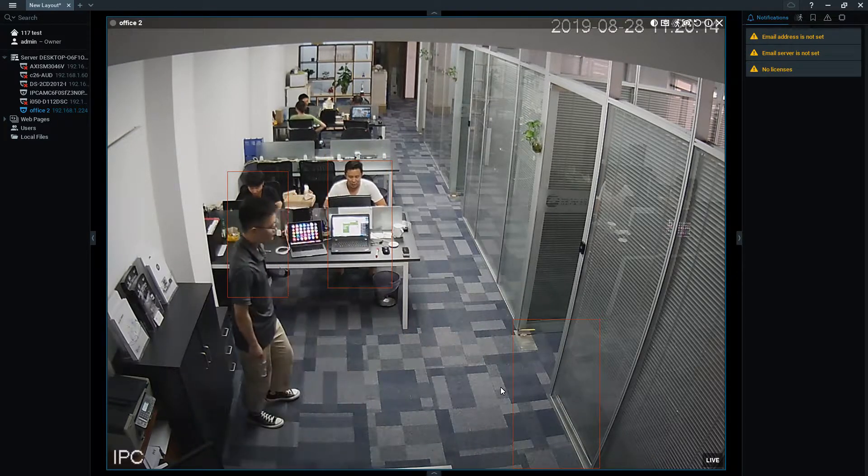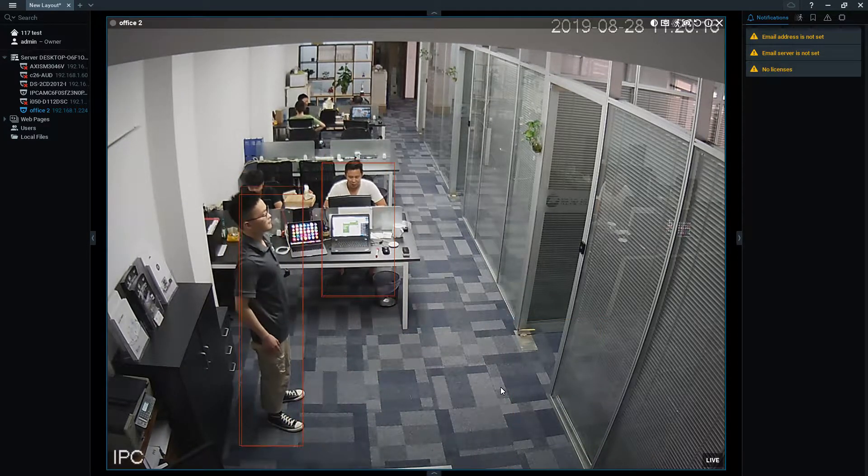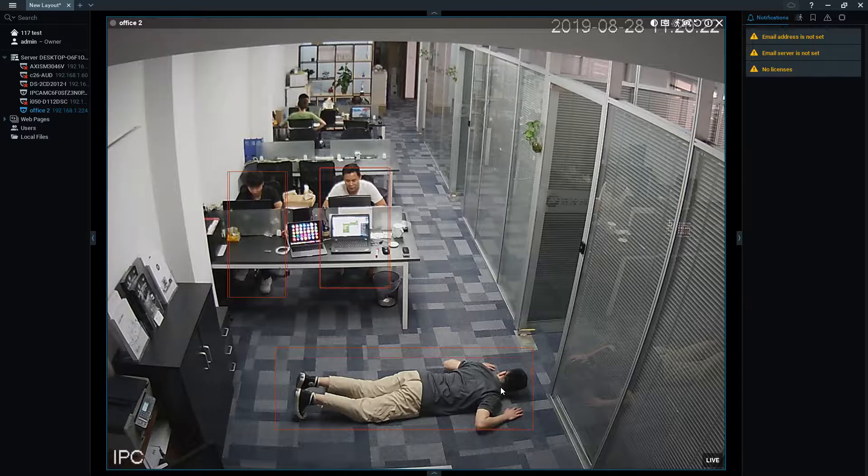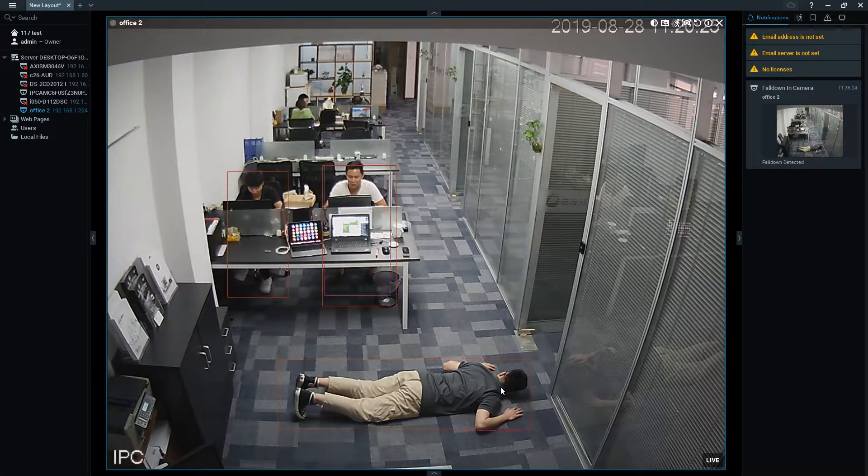We're going to run the first fall posture: flat face on the ground. So when you fall flat face on the ground, the alarm will pop on the right side, as you can see.